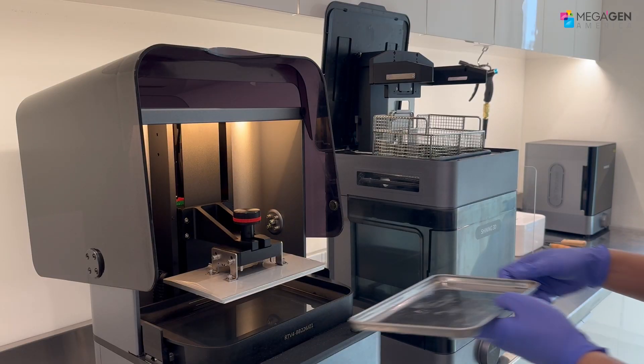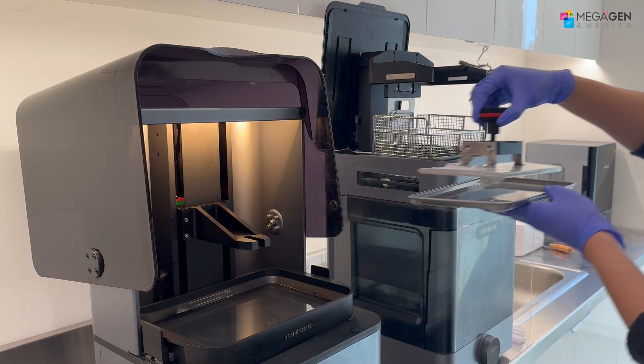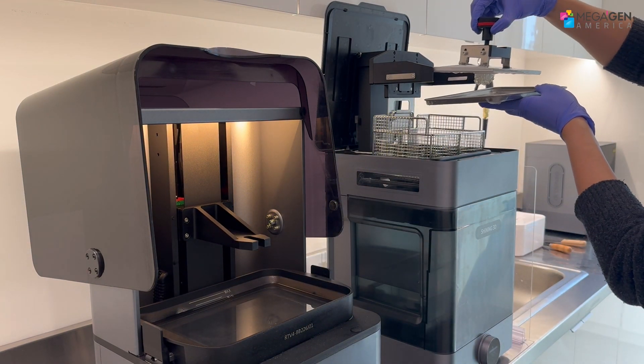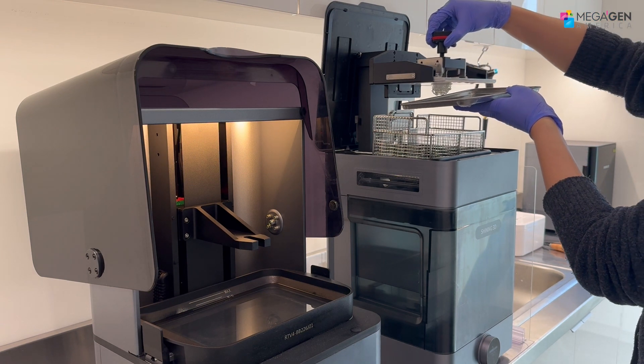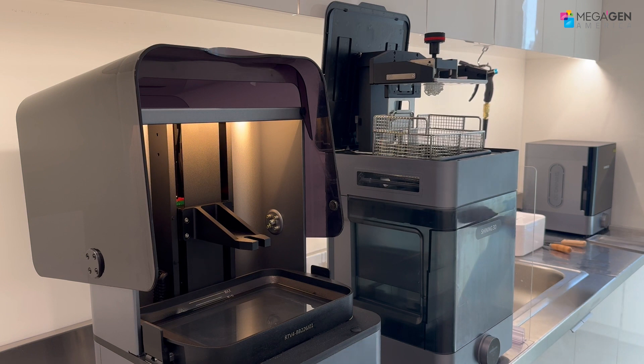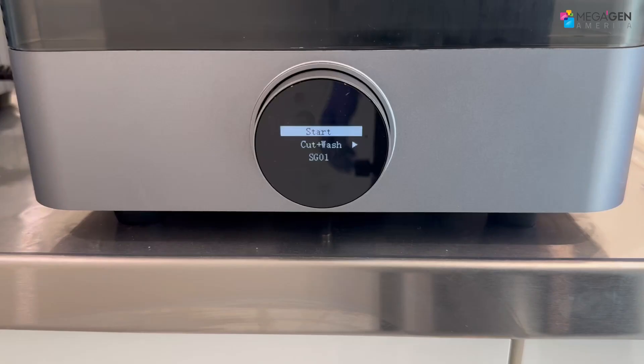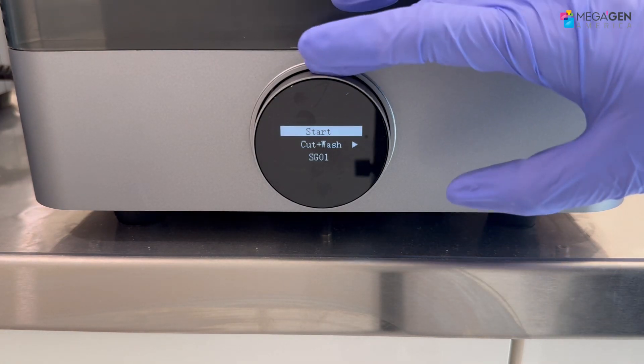The washer will automatically cut the guide and wash it. Other printers require you to scrape the model off the platform manually and that will get messy. Select the resin brand and type in the washer.